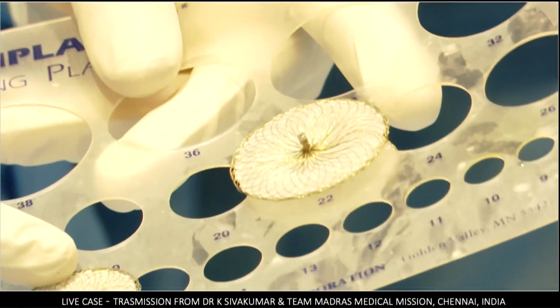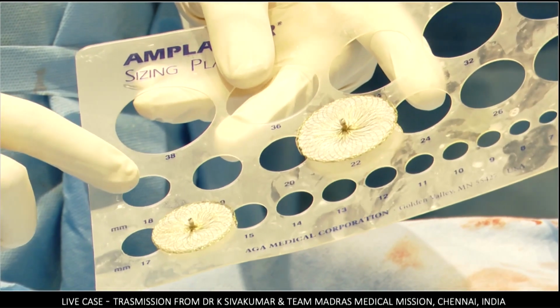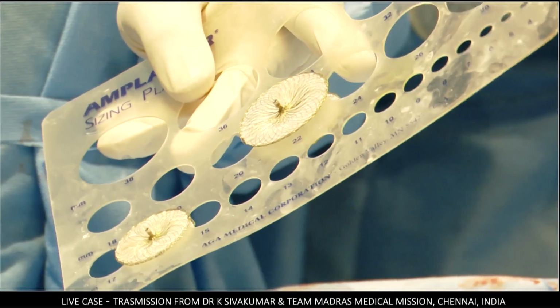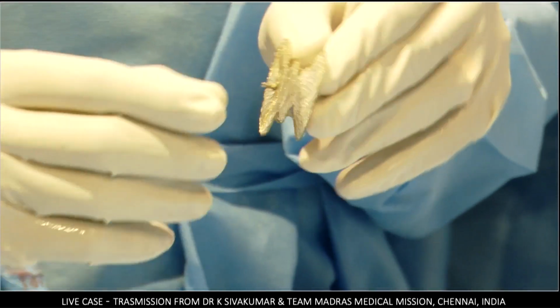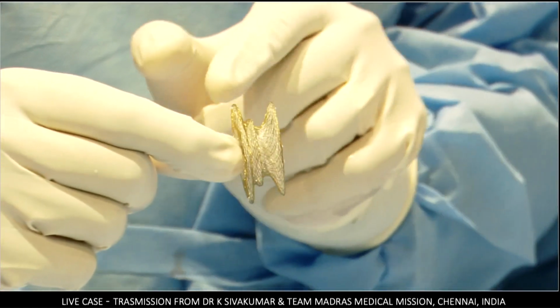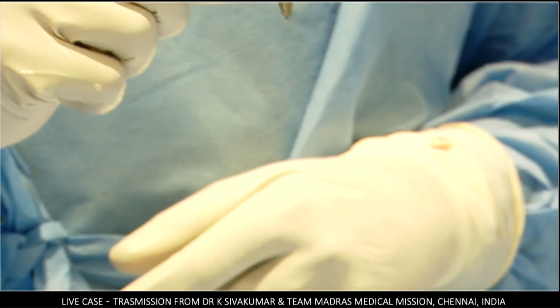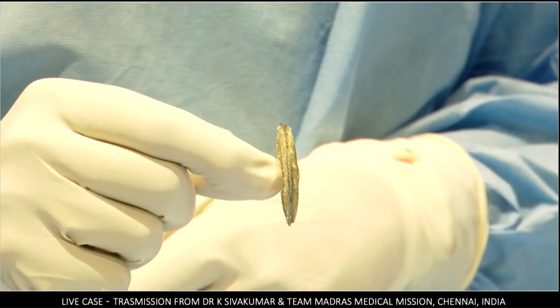Similarly, the device that I have kept here is one that can go for 14, 16, and 18. Having said that, these are the three differences. Number one is left atrial and right atrial discs are similar. Number two is the screw is longer. And number three, it has got differential waist, and it is supposed to be a little slimmer. So the waist distance is just 3 to 4 millimeter.